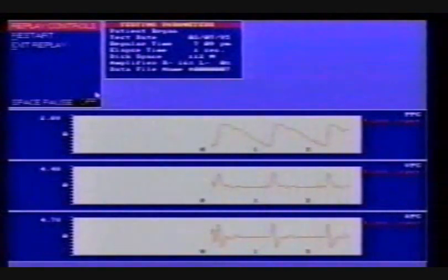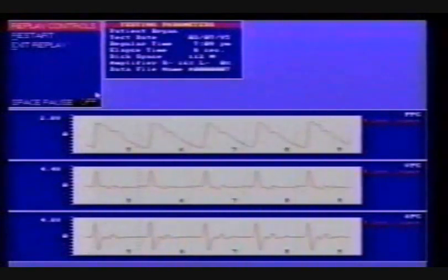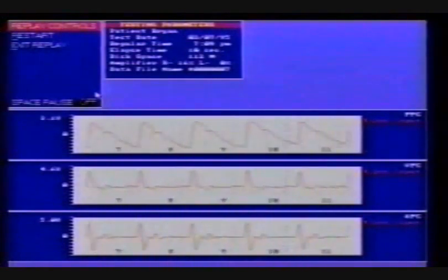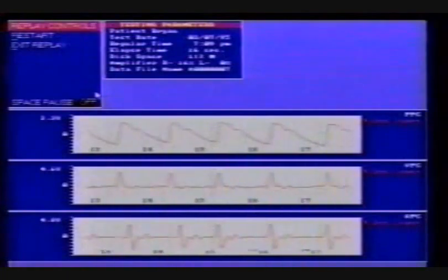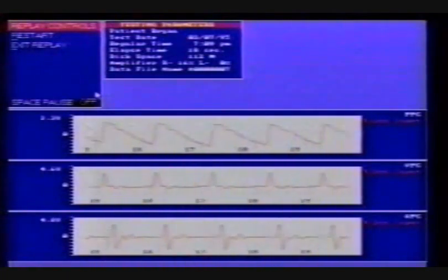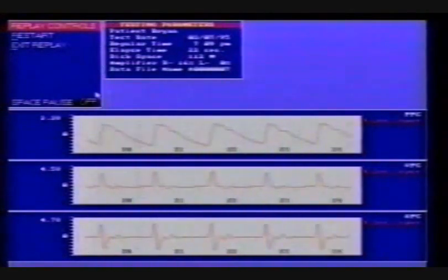The top band contains the classical plethysmographic recording. The middle band contains the first derivative, or the velocity plethysmogram. The third band at the bottom contains the second derivative, or the acceleration plethysmogram. This is the APGram recording on which all our calculations are based.